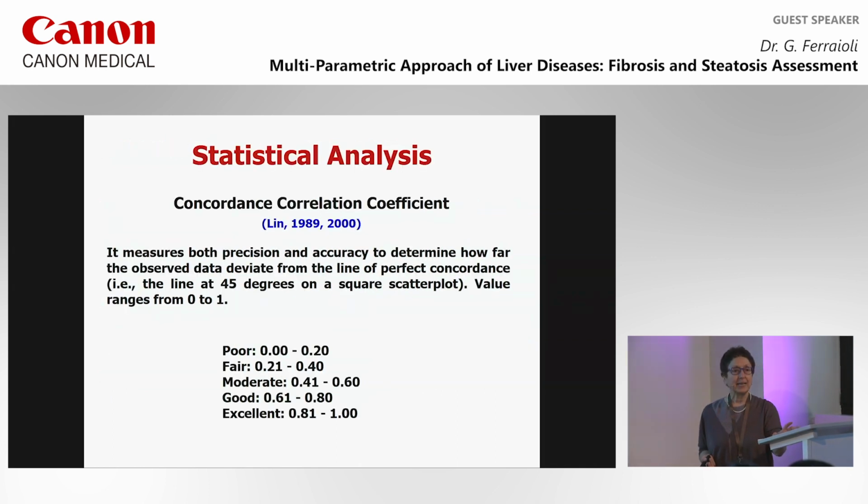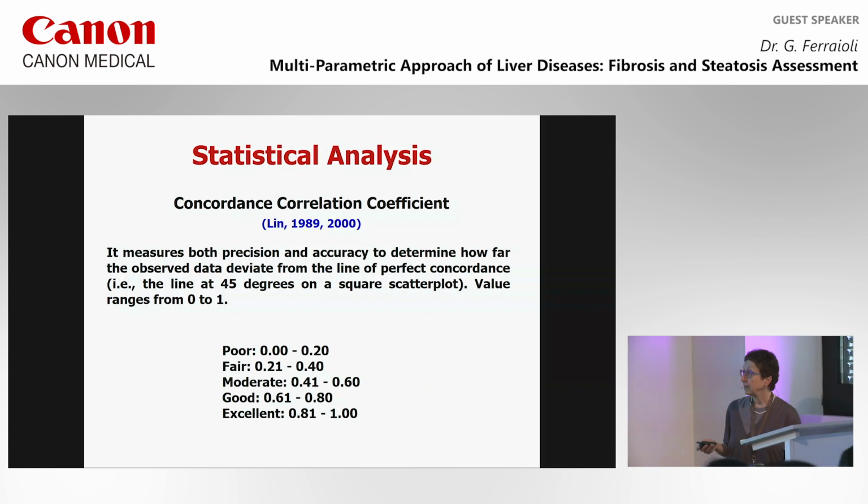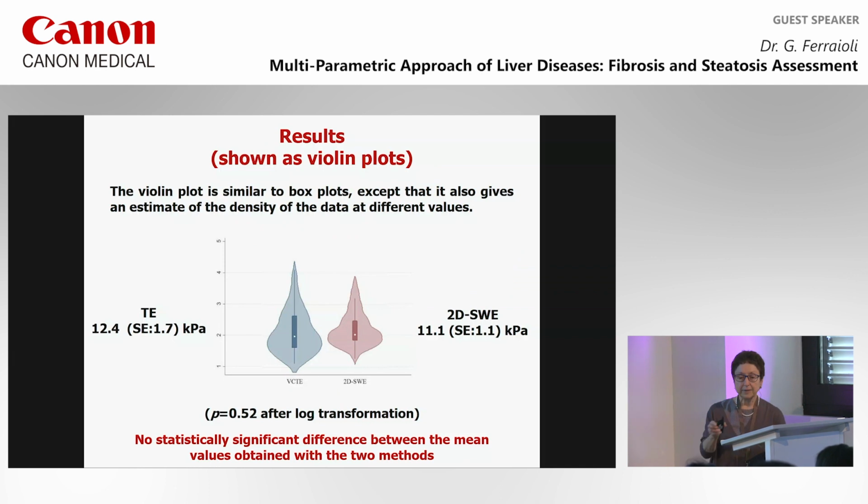The statistical analysis was performed using the concordance correlation coefficient. This is a statistic that takes into account both the precision and the accuracy. And concordance is excellent when the value is above 0.81. And these are the results that we have obtained.